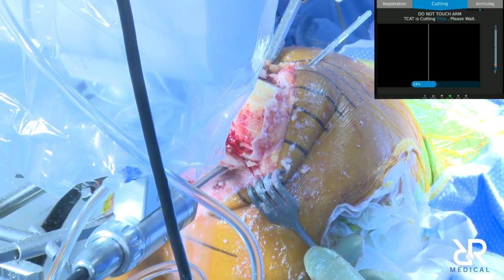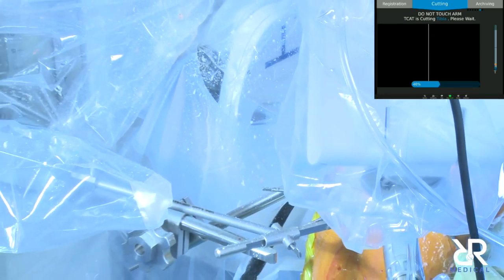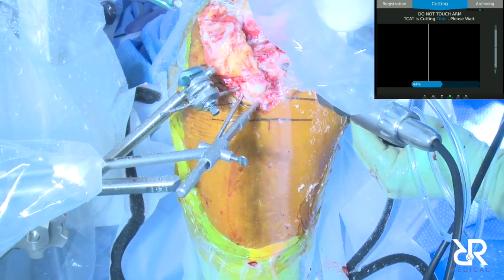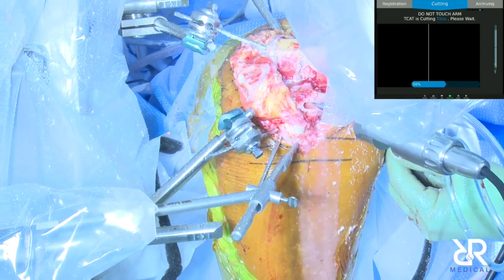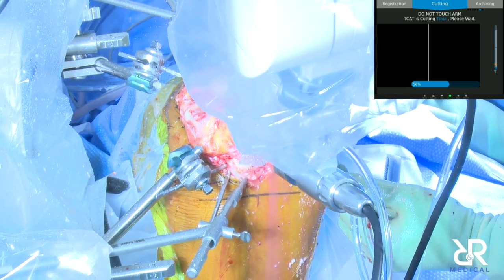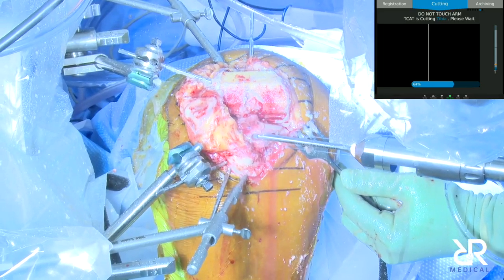So I planned 7.5 distal, medial and lateral, 7.5 posterior, medial and lateral. So assuming that the cartilage is about 1.5 to 2 millimeters in a small lady. And then on the tibia, I planned 7.5 lateral and I think 5.5 medial. And that gave me a varus tibial cut, I think, of 2.5 degrees. And my overall mechanical alignment was 179, so 1 degree of varus alignment. I doubt that I'll have to do any balancing.